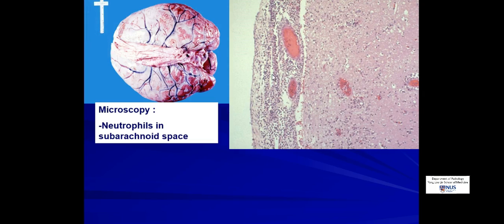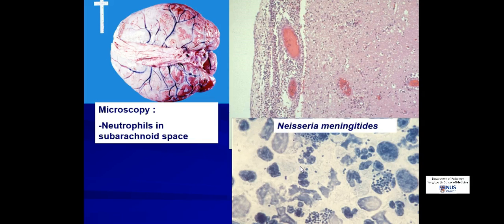For example, this is a histologic section showing the CSF in the subarachnoid space. We can see lots of neutrophils here. And we may occasionally be lucky enough to be able to see the causative organisms. In this case, it is Neisseria meningitidis, which is an intracellular gram-negative diplococcus.